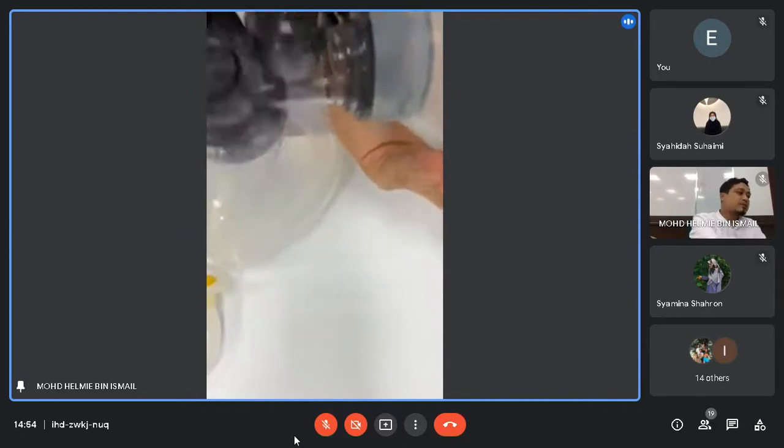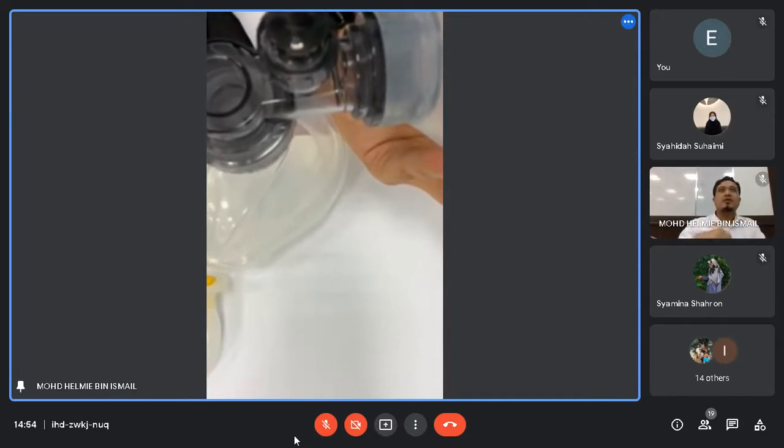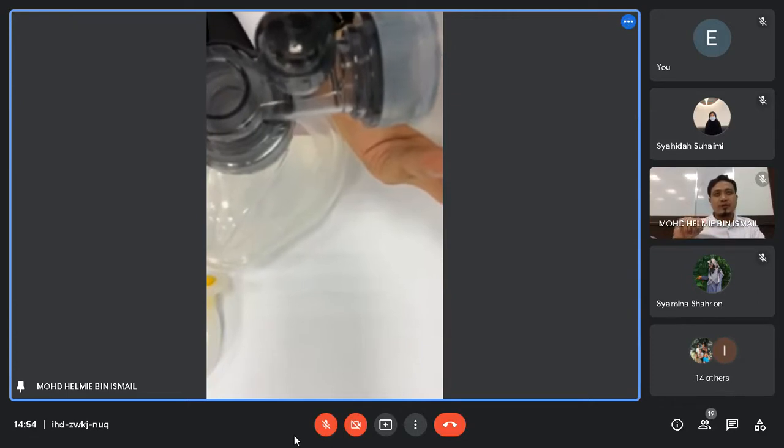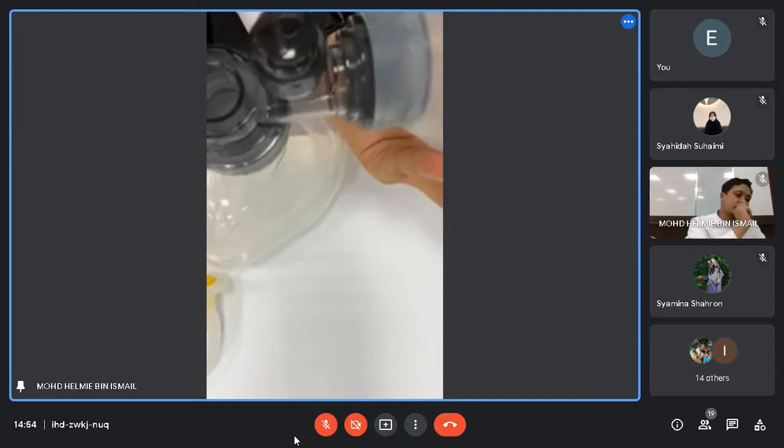What we set lah, the maximum that we set about 5 water pressure, 5 water pressure PEEP. You set, and then once you bagi, dia akan equalize to 5.